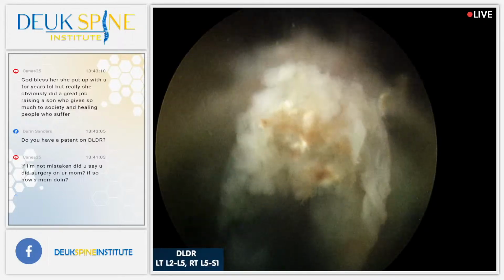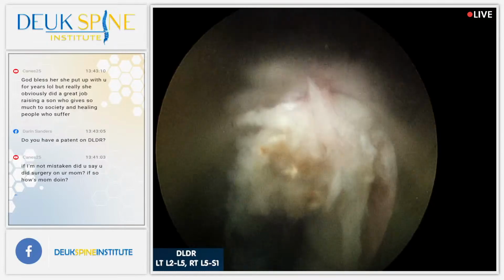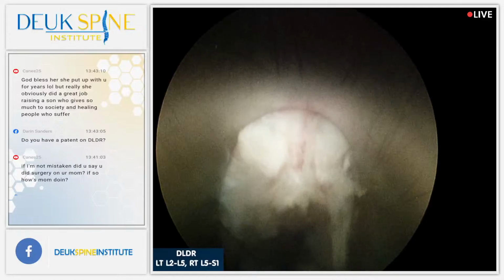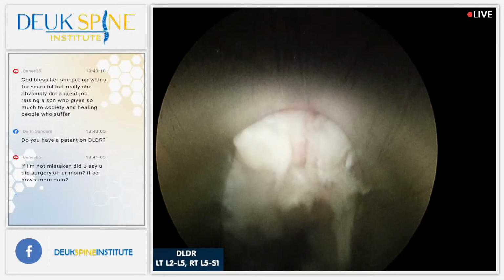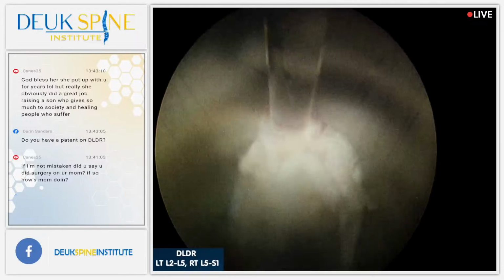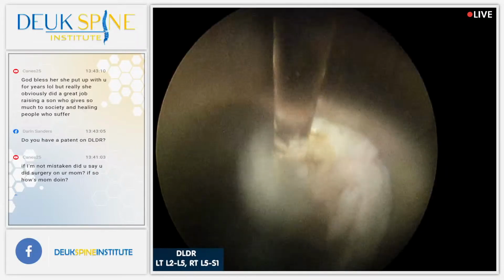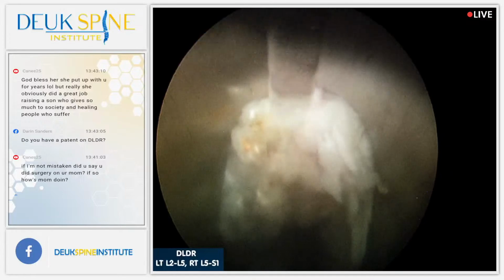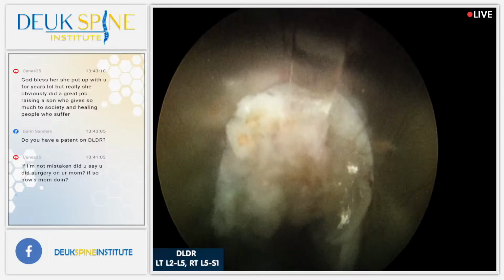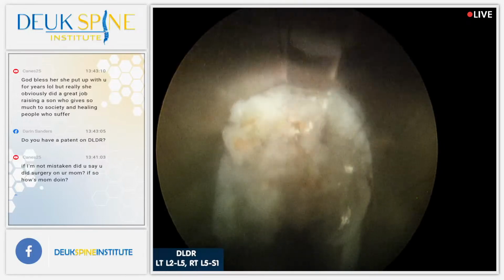I mean, the special effects were hilarious. My gosh, look at all that inflammatory tissue. I'm feeling like we should get a picture of that. Take a picture and let's add it to his video testimonial for tomorrow when he does it. The special effects were kind of amusing. There's the pink stuff right there. You see that? Yes, we do.